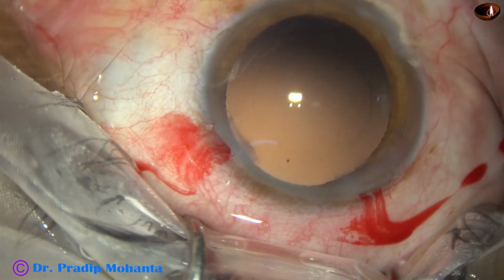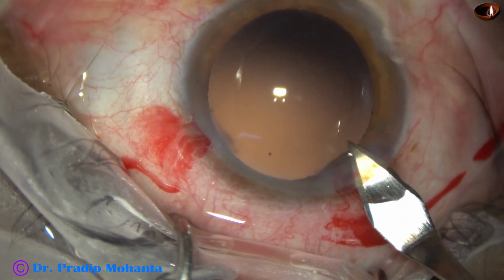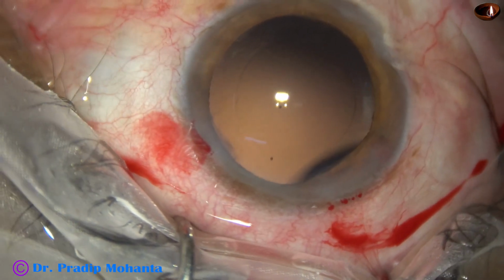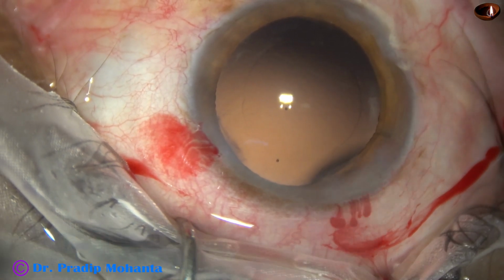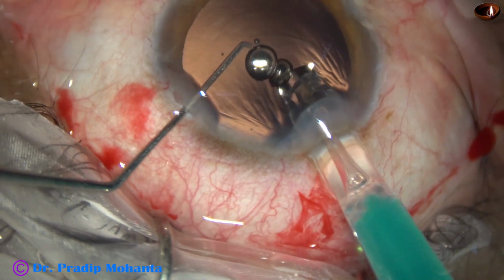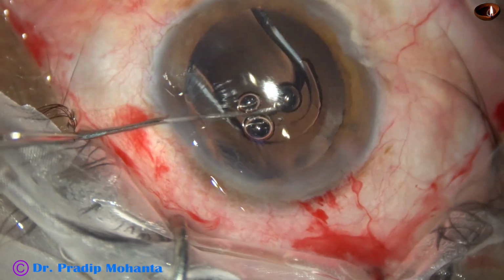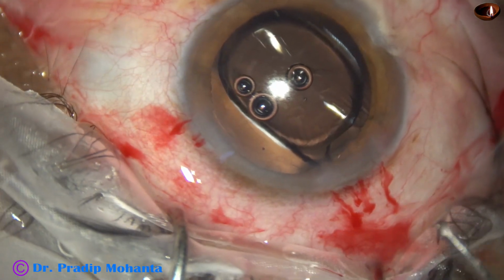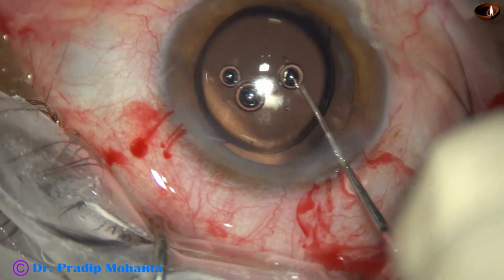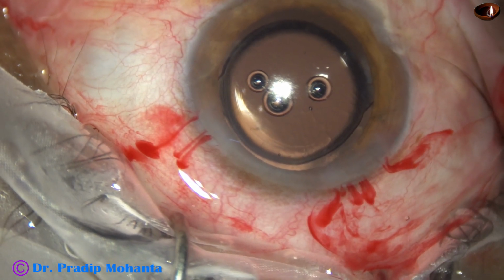By wound assistance, we can implant this lens by 2.8 millimeter wound, but I am going to enlarge it a little bit, maybe by 0.1 or 0.2 millimeter. So maybe the size of the wound is now 2.9 or 3 millimeter. And see how easily the lens goes in the capsular bag. And by the left hand instrument, the lens has been placed in the bag. Dial the lens by the chopper itself. This is a very small Sinskey hook like chopper. It is known as Mohanta's chopper.